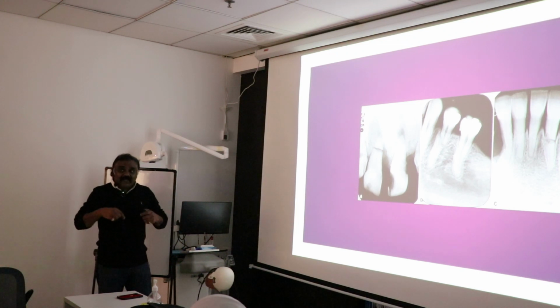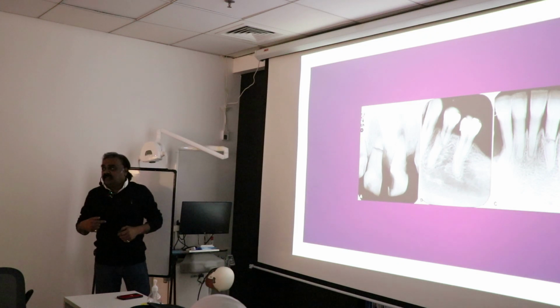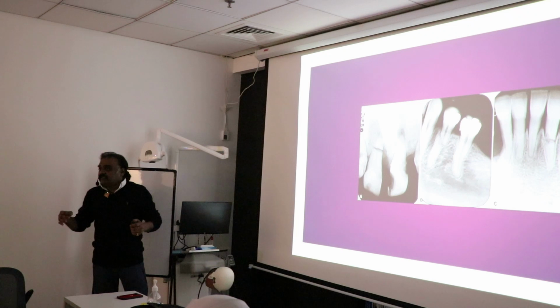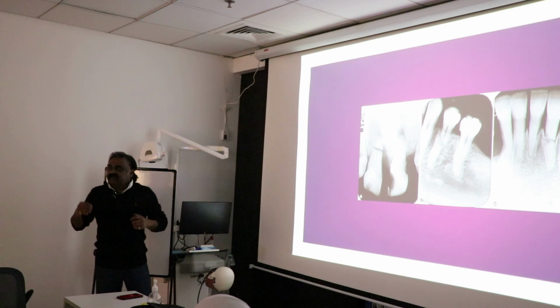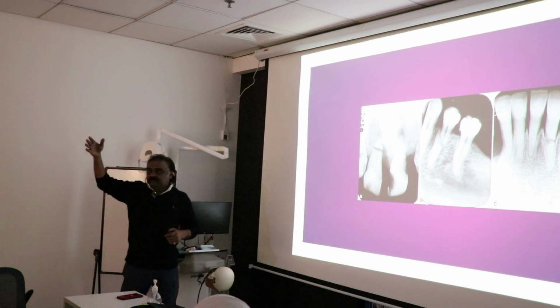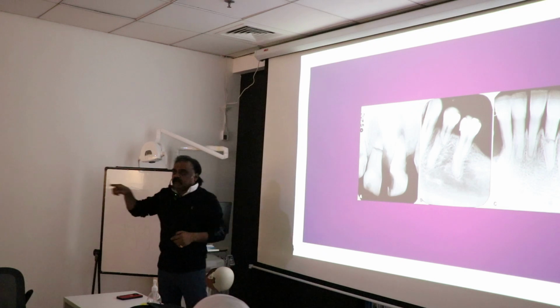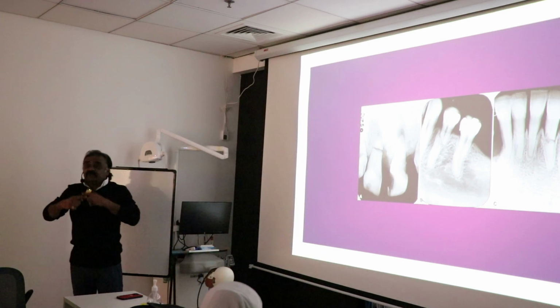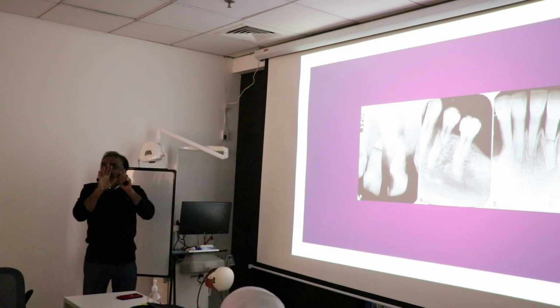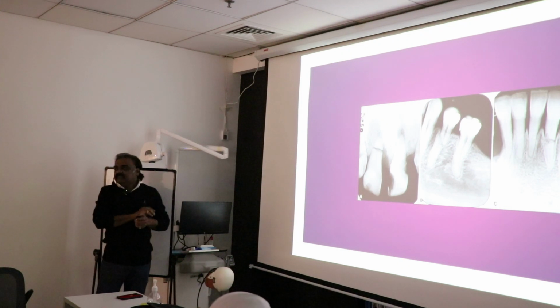The advantage of aligners here is relevant to the question that was asked by Dr. Suhail, because with aligners, whatever you say and do, the amount of movement achieved is only to the tune of 0.75 to 1 millimeter per month. What you can ask the patient to do is continue to wear the same aligners for about 5 to 6 weeks before you change them, because that retains the corrected position, giving it sufficient time for stabilization.